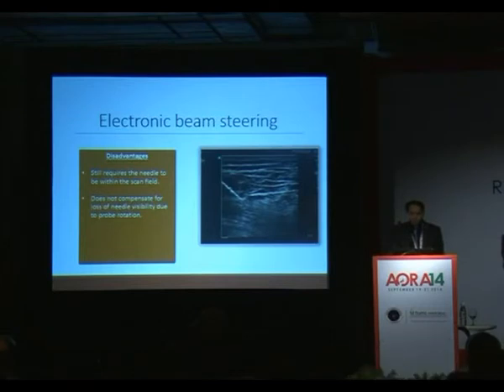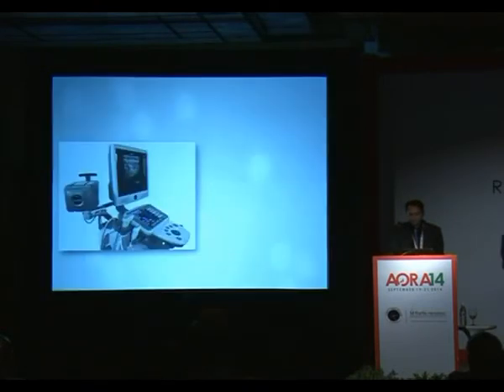And if you don't, once again, if you rotate the probe, you're going to get only parts of the needle highlighting. You may not even see the tip sometimes. The tip definition is a little iffy with this technology. And with an out-of-plane technique, you really won't get the angles required to highlight the needle.